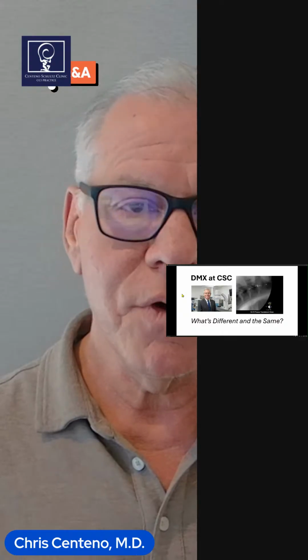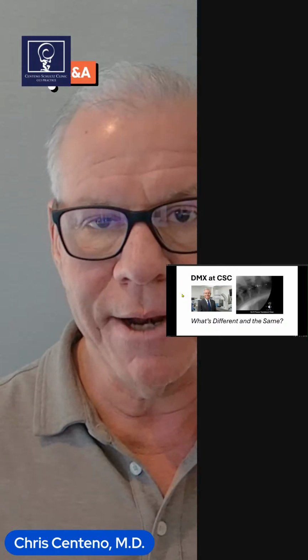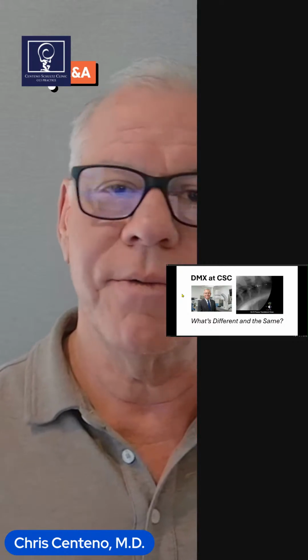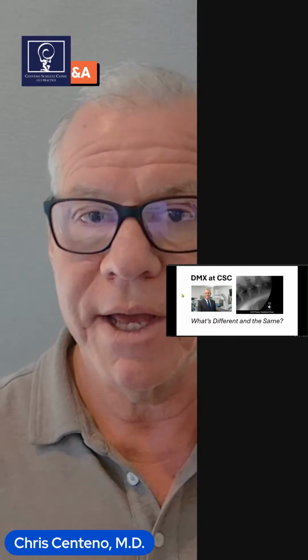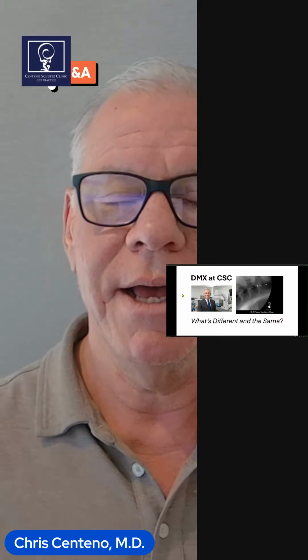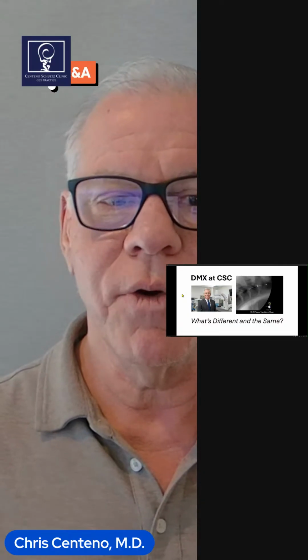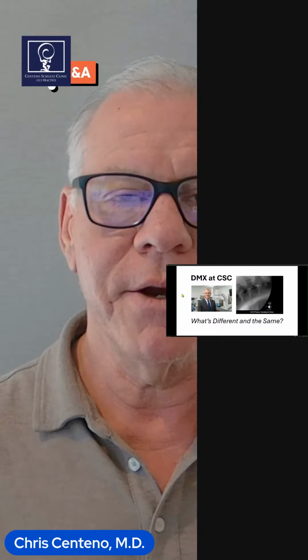But this is one of the movement-based imaging concepts that's really key in looking for instability in the upper cervical spine. And as such, for years, we've worked with Dr. Katz's office in Boulder. Dr. Katz is a leader in this field. He's published an immense amount of research on DMX, what's normal, what's abnormal, and I really owe a big debt of gratitude to Dr. Katz for doing that. We've worked together for years.